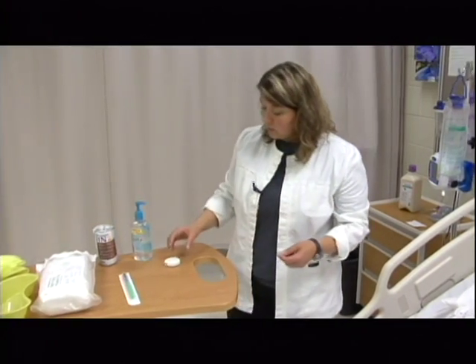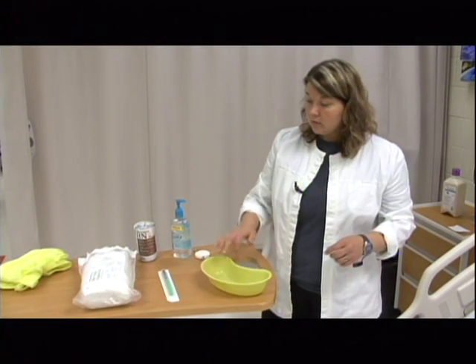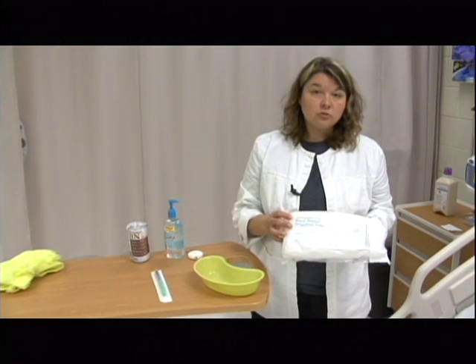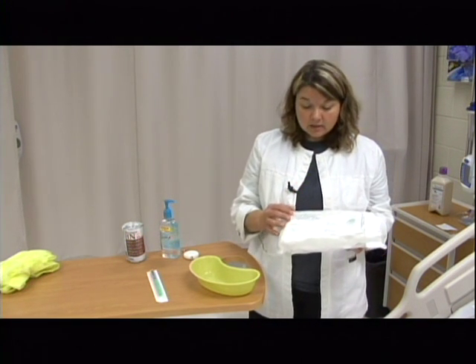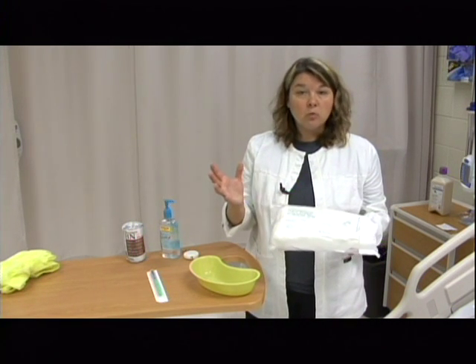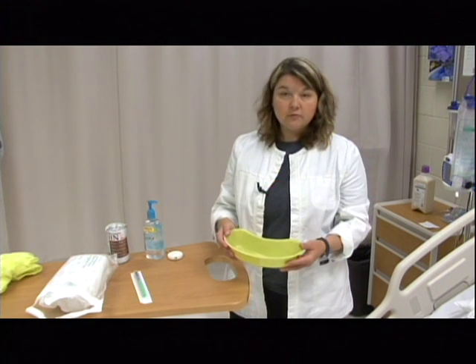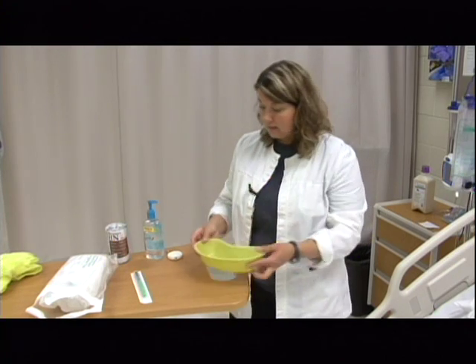Some of the other equipment you will need, certainly I already used my tape measure to confirm placement. Whenever I am assessing and accessing her tube, I'm going to use what we call a Barred piston irrigation tray set, and you may have some different type of material depending on which facility you use, but this comes with the piston irrigation. It has a little container that you can put your warm tap water in for your irrigations, and it's got a little tray in here. Certainly I've got an emesis basin and I've got some pH paper in here, because if your facility policy requires that you check the pH on the gastric contents, then you would need this.